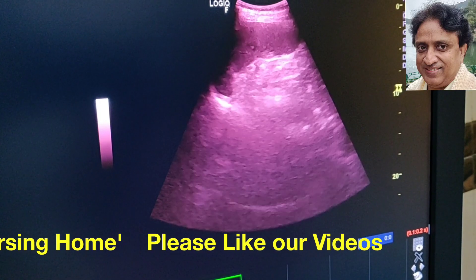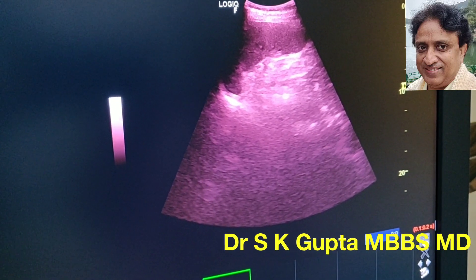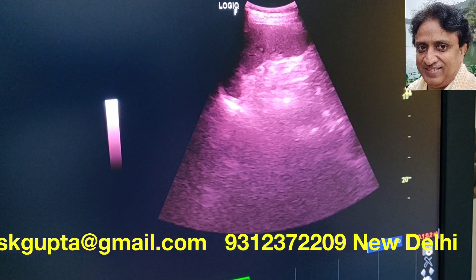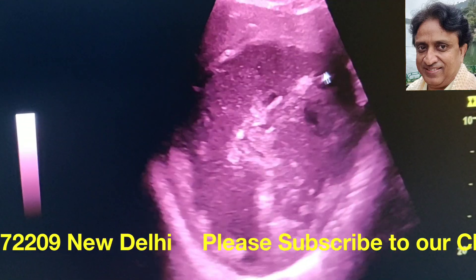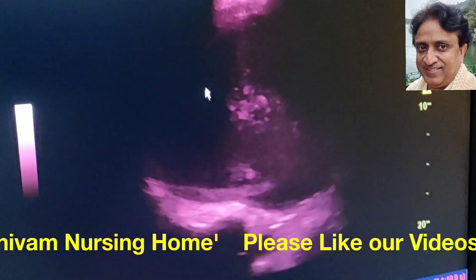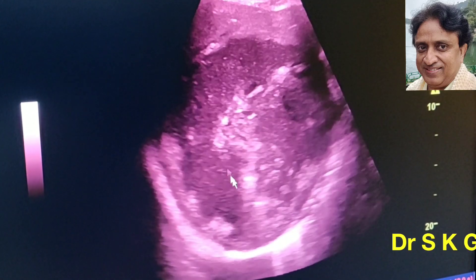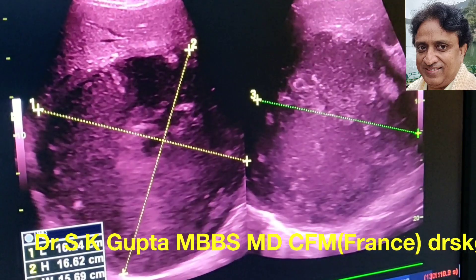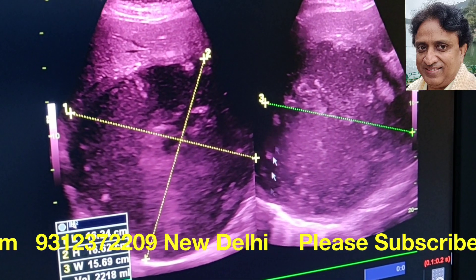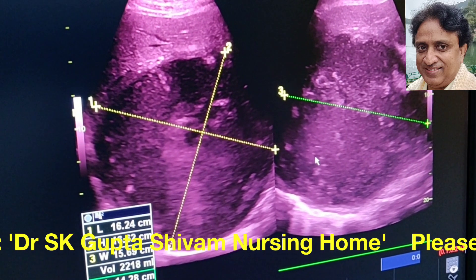The necrotic material is still there, but the fluid in the liver parenchyma seems to have been partially drained. The spleen remains normal in size. While on intercostal drainage, this patient developed a tract, and from there a leakage of liver abscess contents occurred continuously — fistula formation. Once the drainage tube was removed, the necrotic material started accumulating much more, and the abscess grew to 2,218 ml.